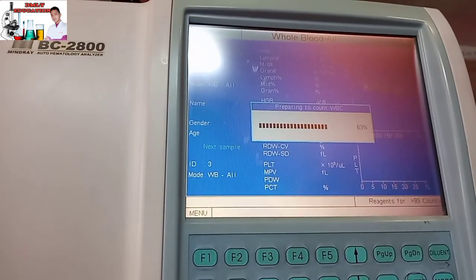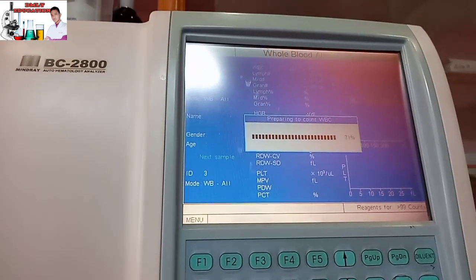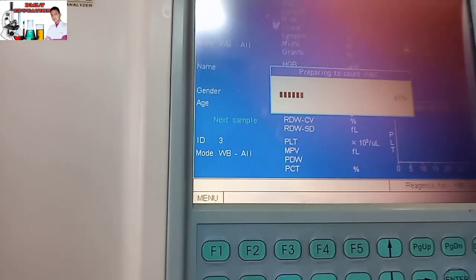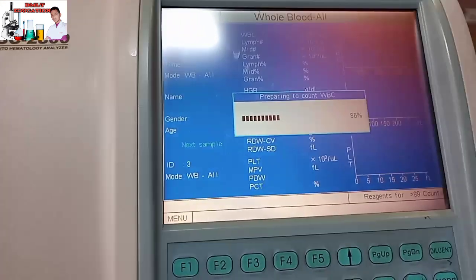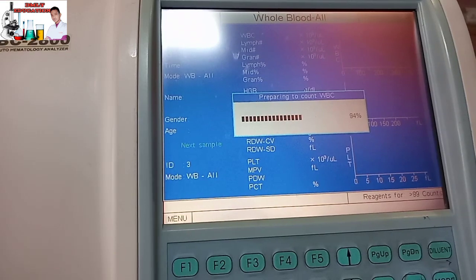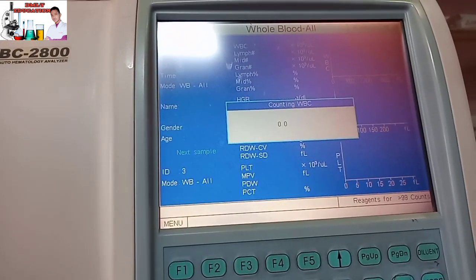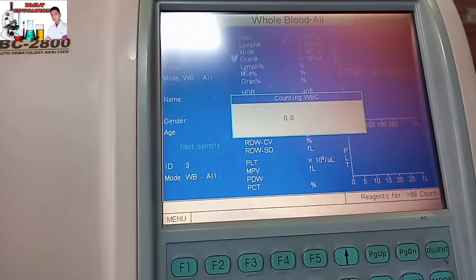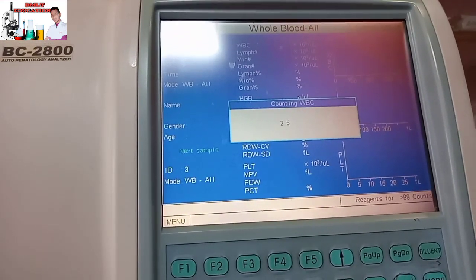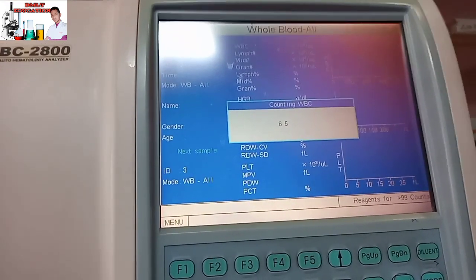Step by step, we will prepare to count WBC. Step by step, count WBC. Step by step, RBC preparation. Step by step, count.